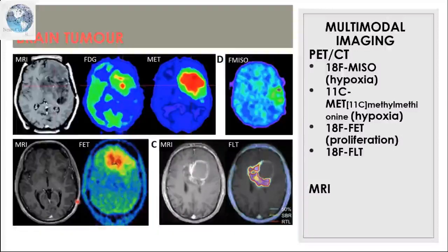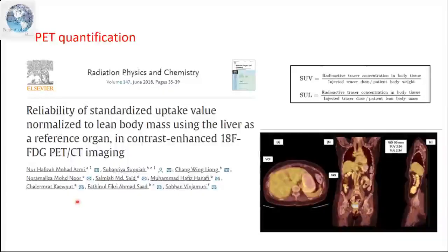So this helps the surgeon, especially because surgeon nak memastikan tumor tu boleh dikeluarkan ataupun bagi radioterapi yang lebih tepat. Tapi pada masa yang sama tak nak efek other parts of the brain, nanti dia boleh lumpuh kalau kita terlalu besar area yang kita nak keluarkan atau irradiate. So dia is very accurate treatment planning. Kita perlu banyak modality untuk lebih jelas. Sometimes tengok struktur je tak nampak how much the tumor has spread at the cellular level. Okay, so that is so useful for that.